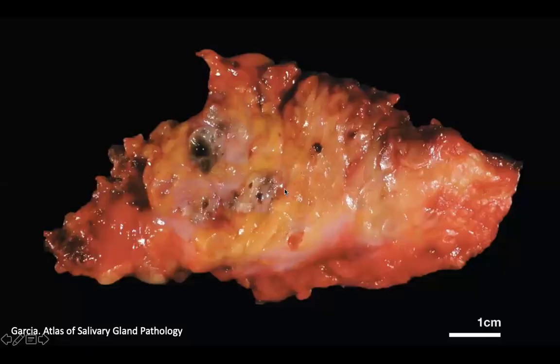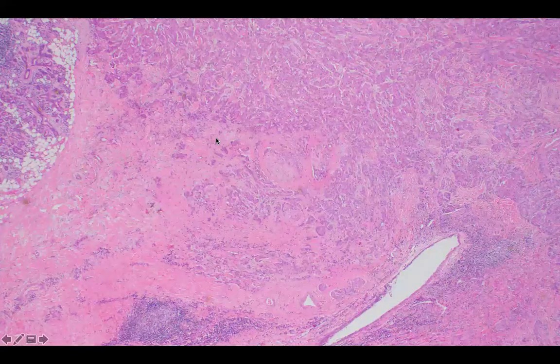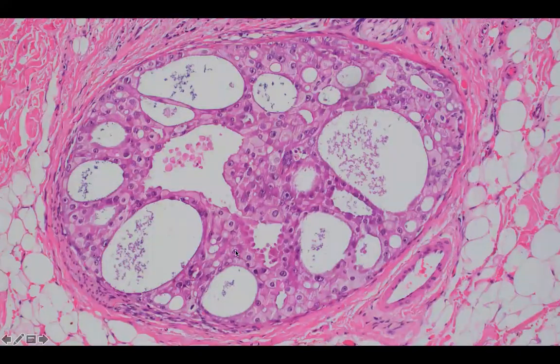All right, I'm going to try to rapidly get through as much as we can now. We have 5 minutes. So this is an aggressive lesion here. Look, a little necrosis. It's a bad boy. And on resection, we see an infiltrative tumor. On another power, we see that the cells are surrounding nerves here. They're highly infiltrative into the surrounding parenchyma, and the cells show abundant eosinophilic cytoplasm, with these weird pink, almost decapitation type secretion that looks sort of like apocrine type cells. And they're in a cribriform pattern. So it sort of looks like an apocrine carcinoma of the breast.